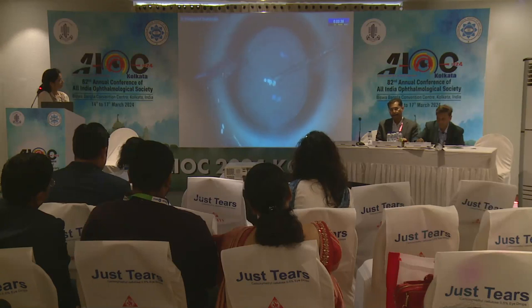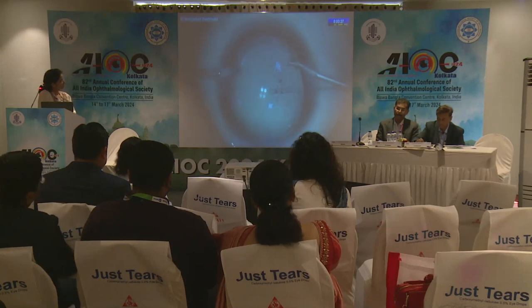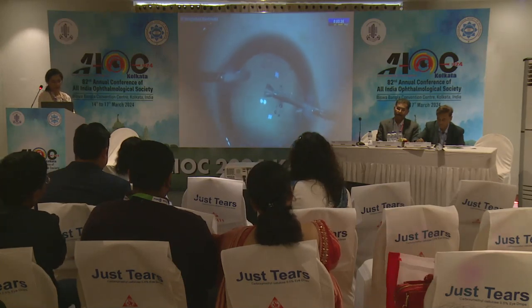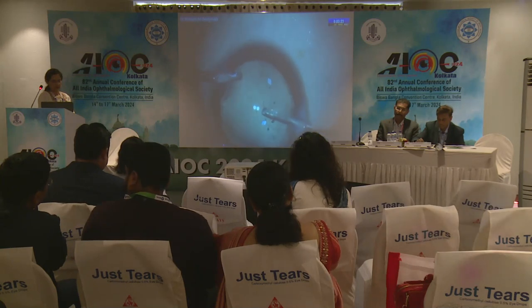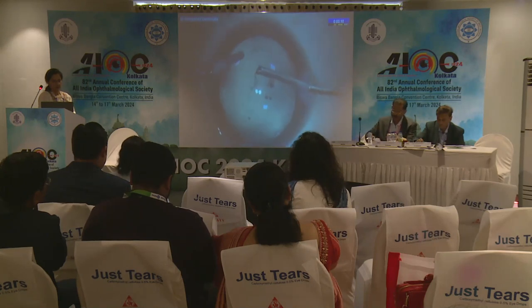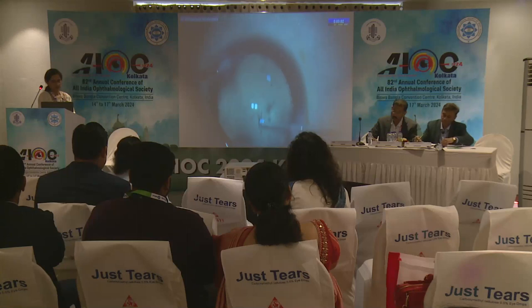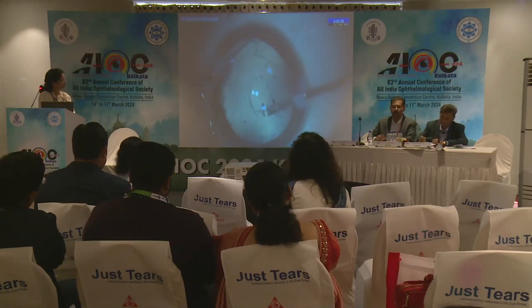I always do primary posterior capsulorhexis in all pediatric cataracts. I'm giving a nick with the cystitome and then injecting a small amount of viscoelastic in Berger's space and completing the posterior capsulorhexis. Grabbing and re-grabbing with the forceps is crucial to achieve a small and adequate size rhexis. The anterior vitrectomy is done.